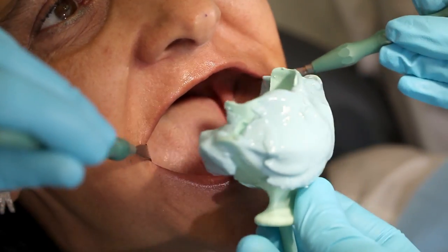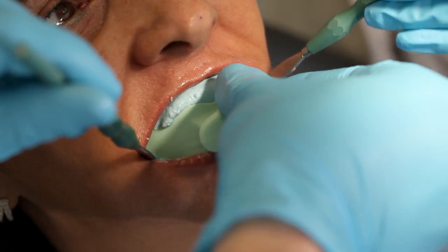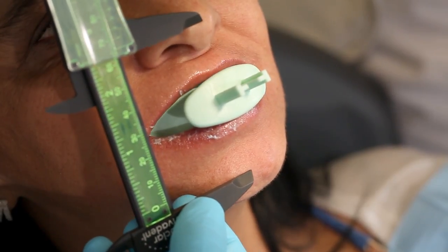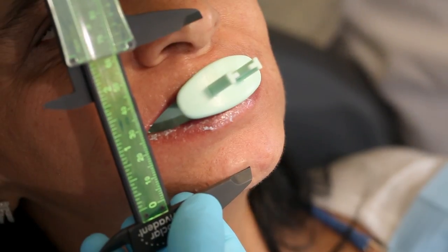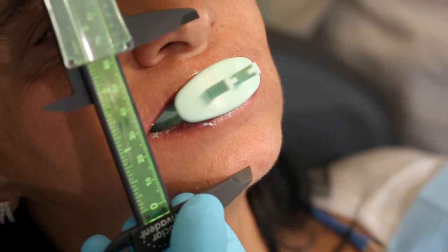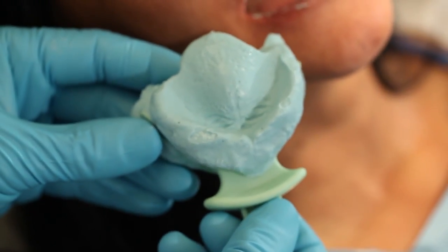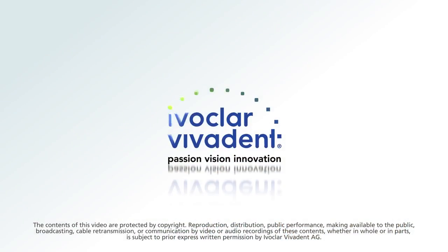Rotate the centric tray into the mouth, moving from top to bottom. Position the rim on the lower alveolar ridge. Ask the patient to close her mouth slowly until the distance measured with the calipers is attained. Now ask the patient to swallow — this will prevent strong protrusion of the lower jaw. When using the centric tray, there is no need to take complete impressions of the jaws; just make sure there is sufficient three-point support so that the models can be articulated.